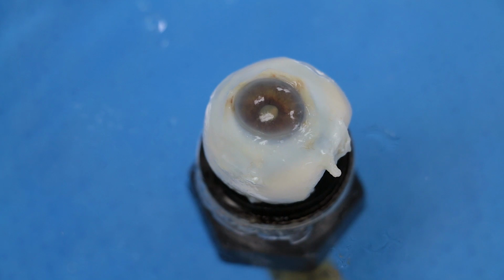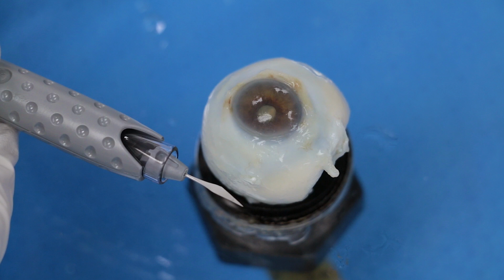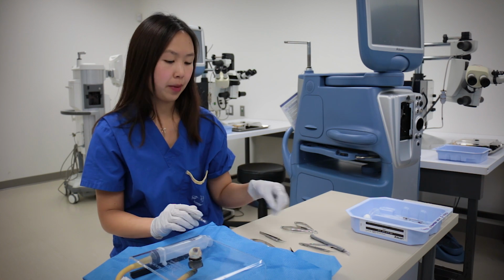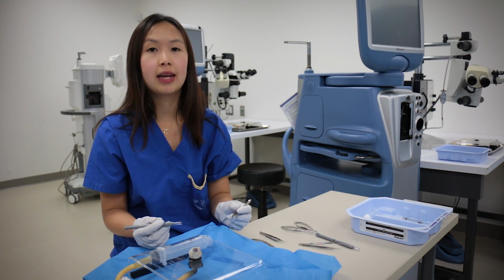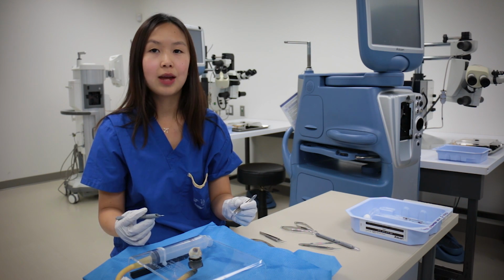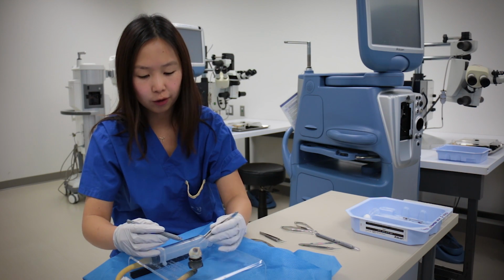In cataract surgery, we create a main wound in the cornea using a keratome, and a paracentesis wound with a 15-degree blade. In corneal procedures, we use a trephine to make a perfectly round excision of the cornea. In this case, we will first use a pair of microforceps, or .12s, to provide countertraction and a 15-degree blade to create the first opening. Then we will use scissors to remove the rest of the cornea, carefully following the curve.